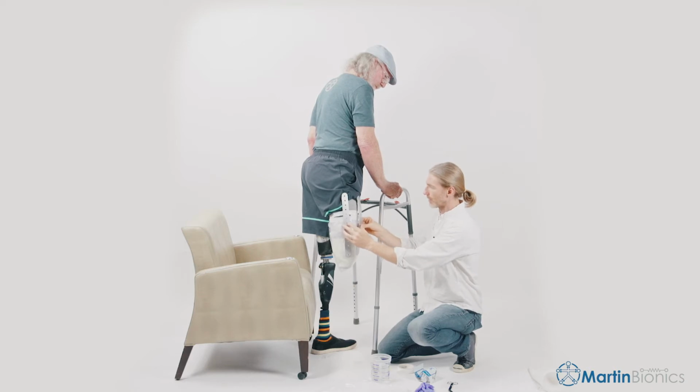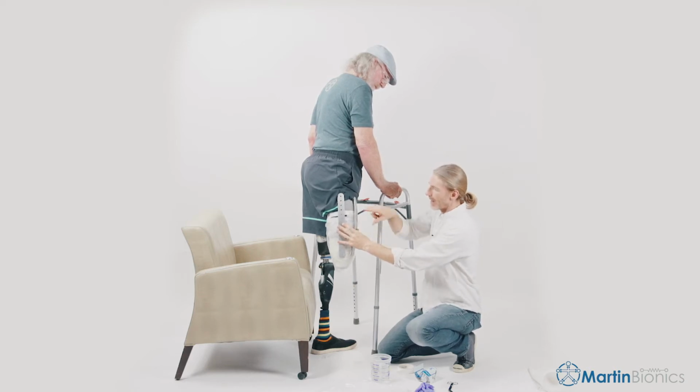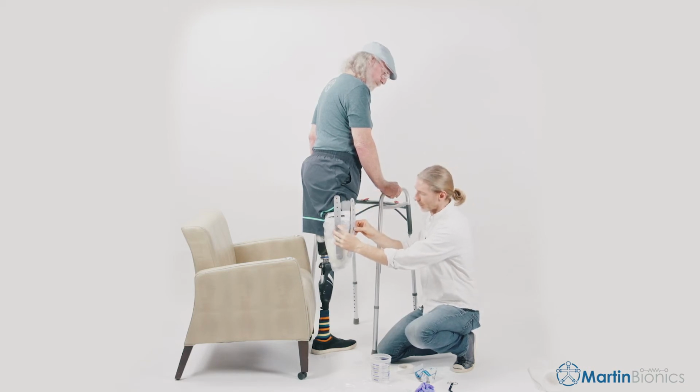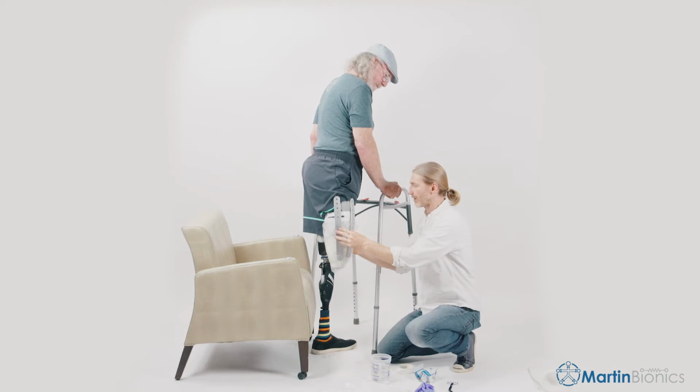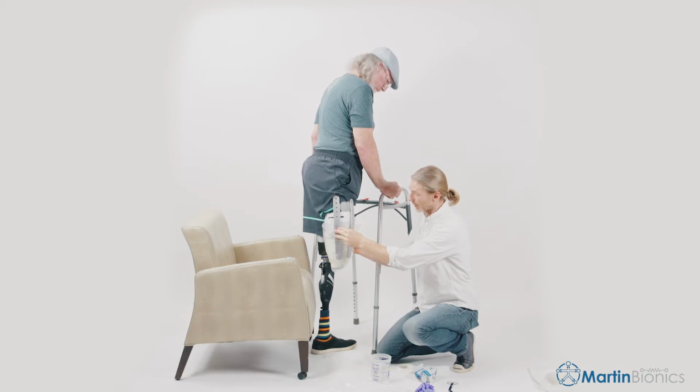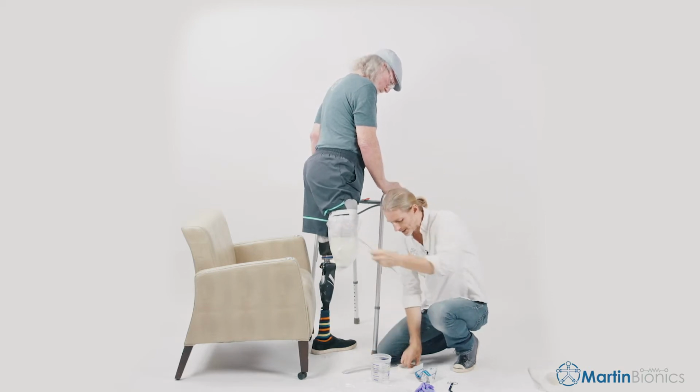And then the anterior medial strut is going to sit at about, if you cut the limb length or front to back dimensions, kind of that measurement, we want this to sit about 2/3 the width of the limb. So about that far apart looks pretty good. It's both almost parallel together, maybe a slight V shape. Then we can bend these struts to shape for the limb. I think this actually looks pretty good. Once these are really kind of form-fit and compressed into the limb tissue, that contouring actually looks pretty good. So I'm going to just tape these in place.